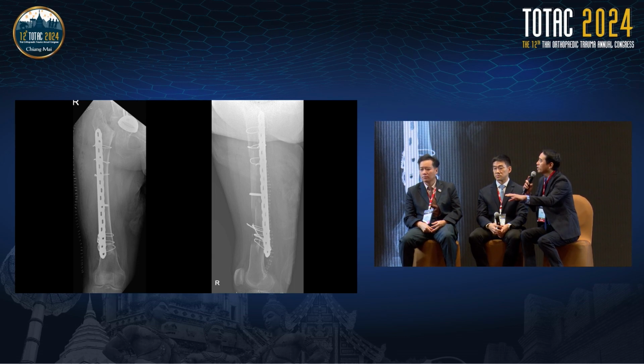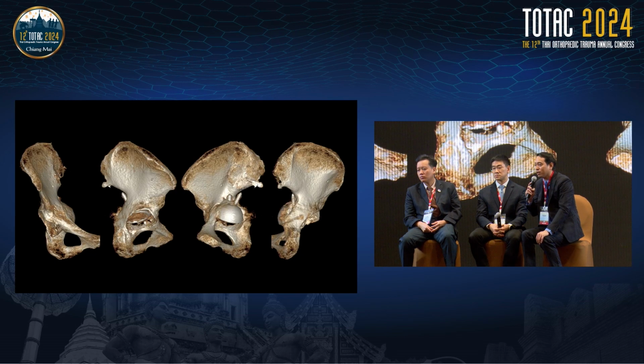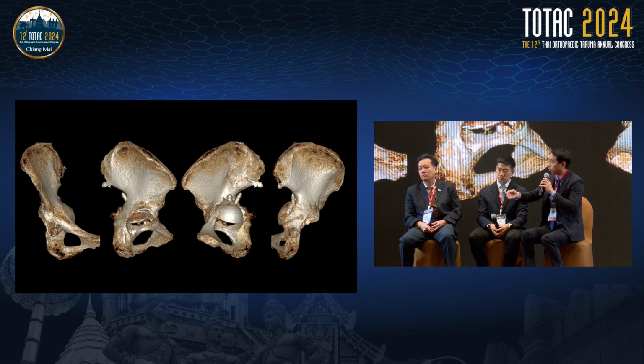Let's go to the CT scan of the acetabulum again. I'm not sure whether the acetabulum is protrusio. I'm not sure whether it's already a malunion from the bipolar or a new fracture. Let's say if it is a new fracture of the acetabulum with a protrusio situation, like in this case, I think the column is fractured.